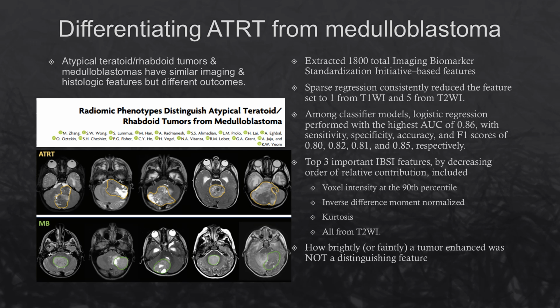The other area this has been used is to differentiate ATRT from medulloblastomas. ATRTs and medulloblastomas have similar imaging and histological features, but different outcomes.